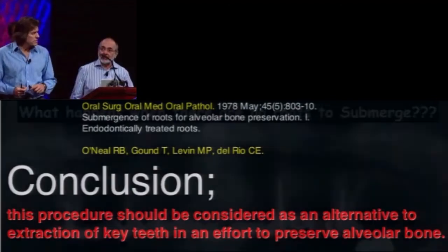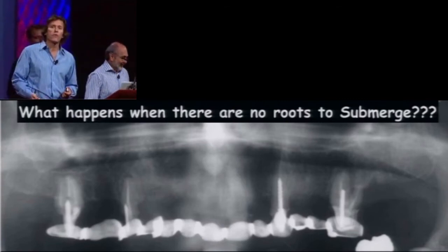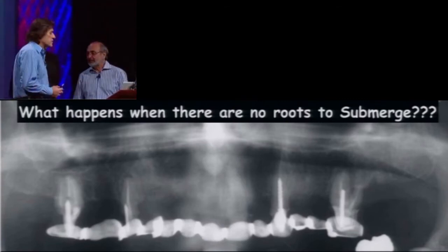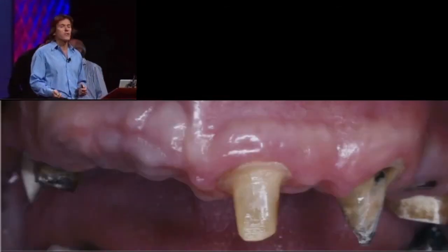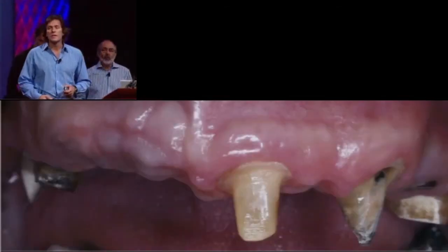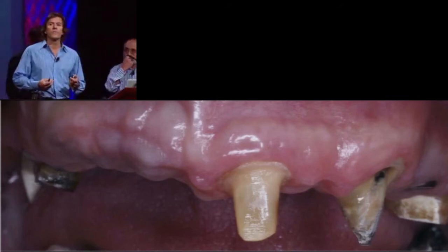What happens when there are no roots to submerge? In a case like this, where we have only a few teeth left just to support a transitional bridge while we regenerate and add implants, we have a large volumetric type 3 deficiency.